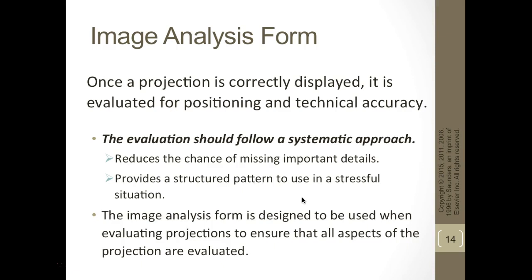So when you have an image that comes up, once a projection is correctly displayed, it is evaluated for positioning and technical accuracy. So the evaluation should follow a systemic approach. Radiologists have the same systemic approach when they're reading, or a very set systemic approach. So you should do this to reduce the chance of missing important details and provide a structured pattern to use in a stressful situation, so that you're in a routine and you're checking over and over and over the images.